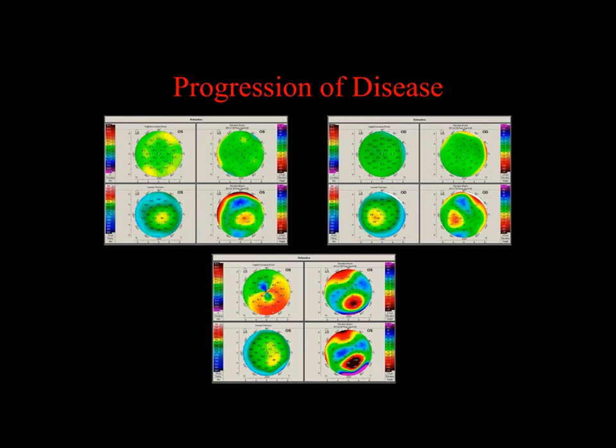And not only that, but posterior ectasia will often precede any changes on the anterior surface. And we call that, and we've published this a few years back, subclinical keratoconus. If we look at the map on the upper left, I'm just talking about the four composite on the upper left.